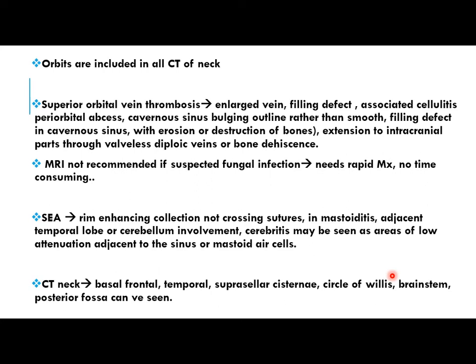For example, when there is involvement of the neck, there may be involvement of intracranial. When there is involvement of the orbital region, again, extension to the adjacent areas. So it's the same findings and the same extensions we have to look for intracranially and in the surrounding regions.